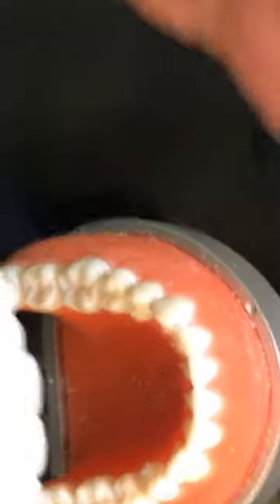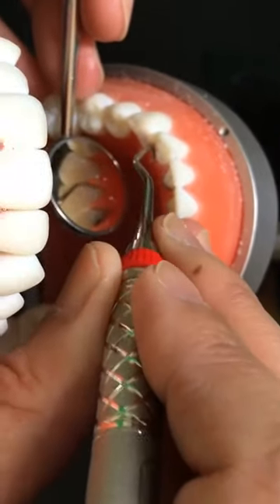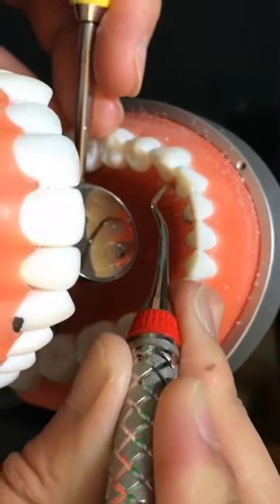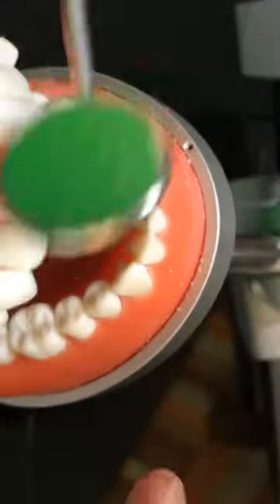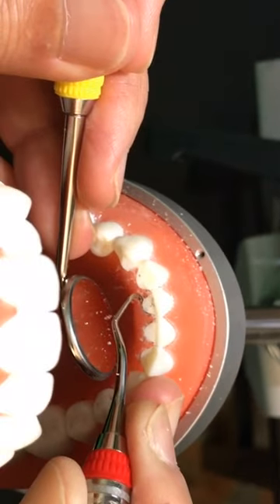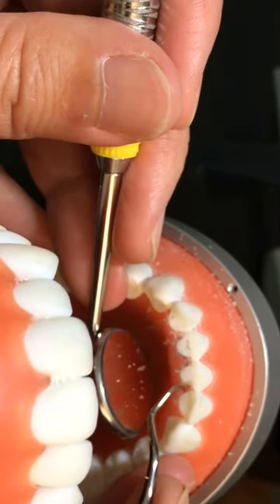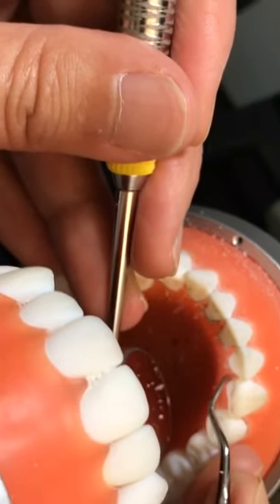Going back to 12 o'clock, then here. Facial surface adaptation — do the surfaces away, the other half. Adjust a little more and move around. One o'clock now — put your stomach right across from the tooth you're working on.